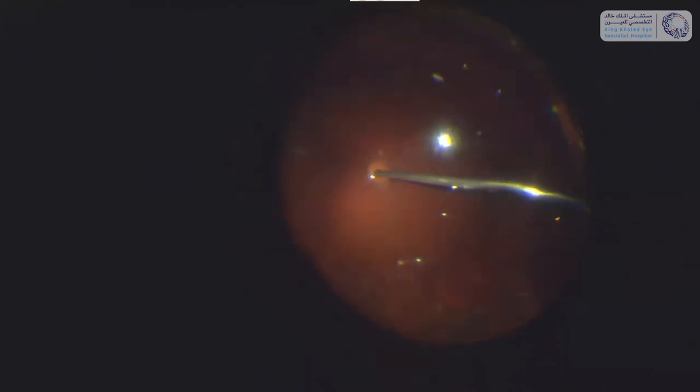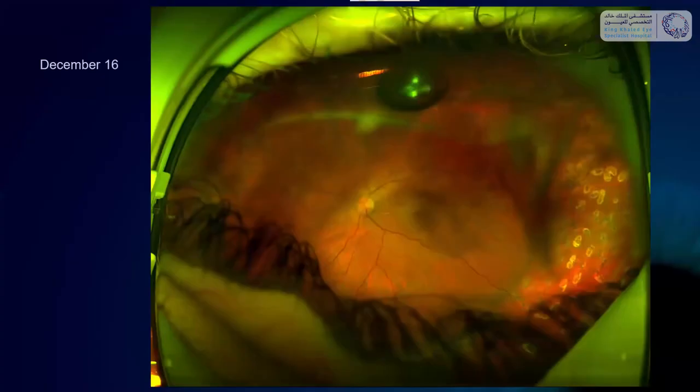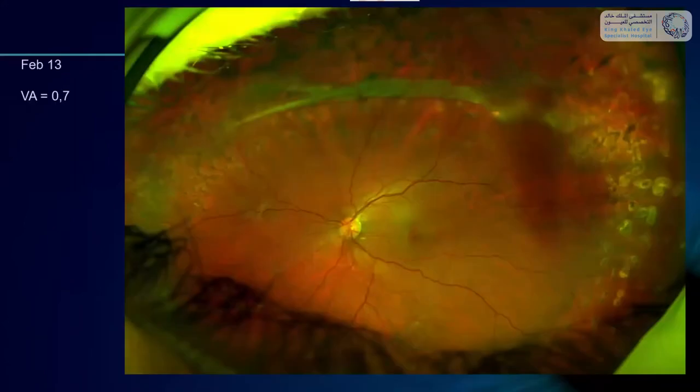After that I continued injecting perfluorocarbon liquid to flatten the retina again, and continued by applying laser. This was followed by a fluid-air exchange and injection of gas — it's in the superior area so gas should work. This was the result early after the surgery. The fold came back partly but not to an extent requiring redo surgery, and in spite of having had four surgeries the patient fortunately recovered to 0.7 visual acuity.